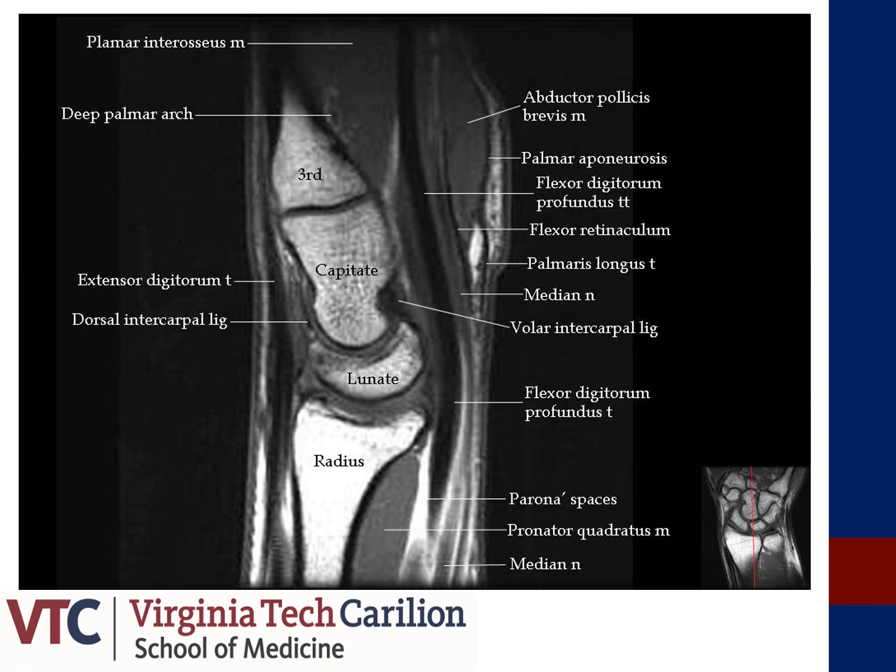Here is another image of the sagittal anatomy. It's essential that we keep in mind the anatomy of the regions which we are ultrasounding in order to assist us with our diagnoses.